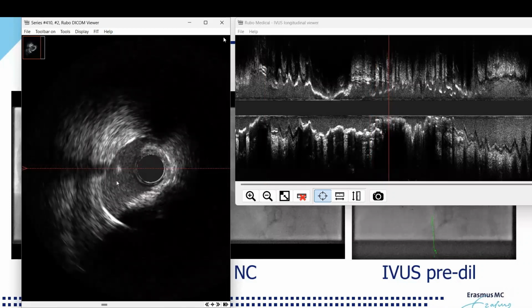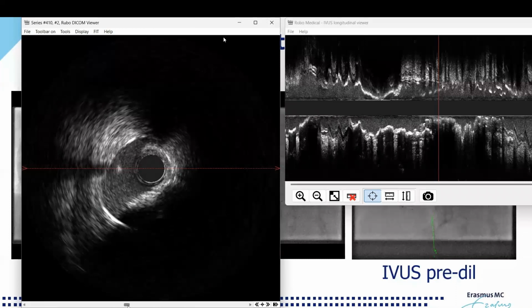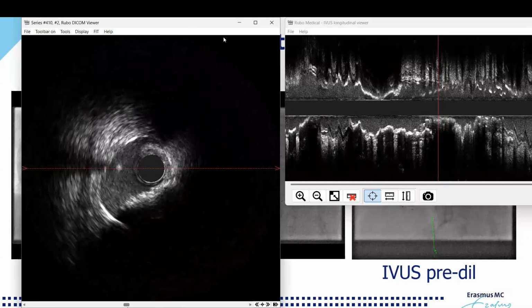You see, still underexpansion, and don't be tricked by the fact that I enlarged the picture a bit, but the balloon didn't do anything. It's still underdeployed, and you can push with your whole family against that, but we need to have some stronger stuff. Yeah.